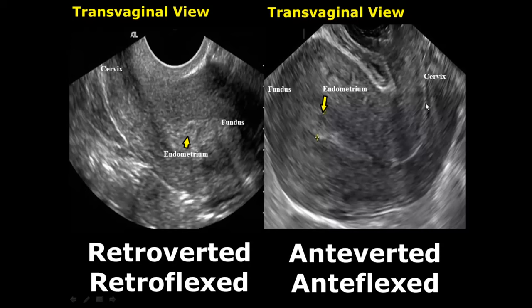Here we have the anteverted and anteflexed uterus. You can see that the fundus is on the left side of the image because it is bent and facing anteriorly. The cervix is also facing upward, so it is anteverted, and the body is folded and facing anteriorly.